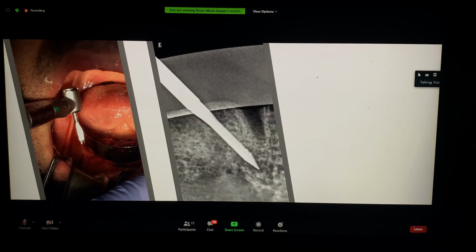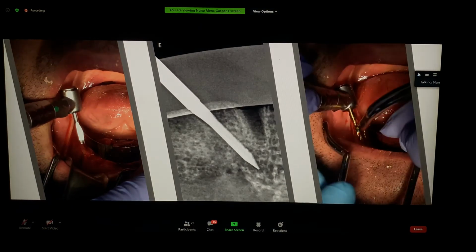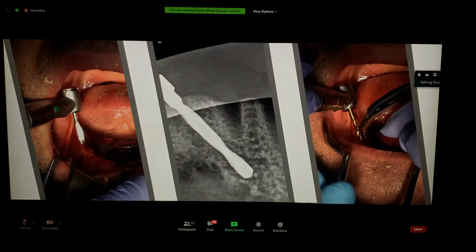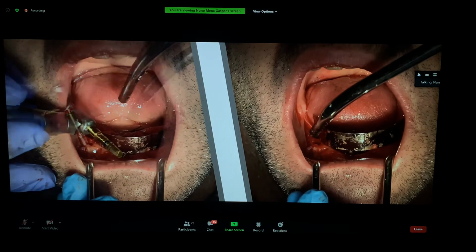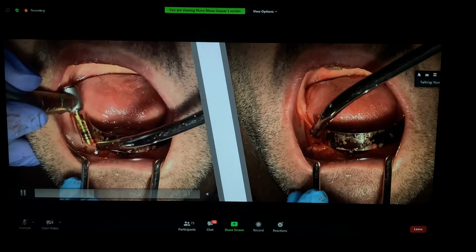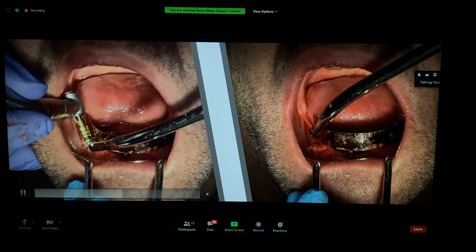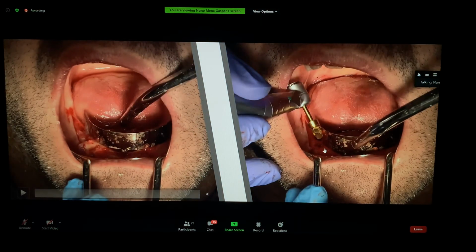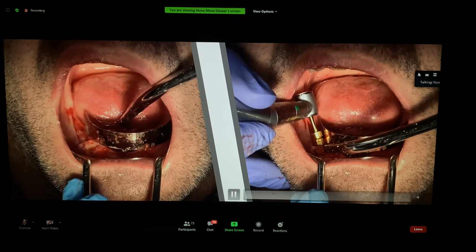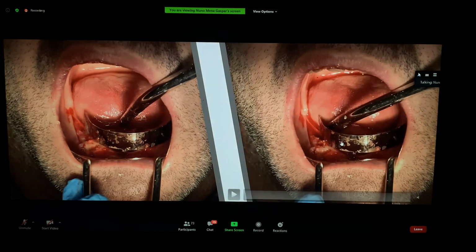Okay, so X-ray control again with the 2.0, and in this kind of bone, very hard bone, sometimes with Enerich you will need to use a drill above the implant diameter. So here I'm placing a 4.5 implant, and this is the 4.8 drill, just with 7 millimeters. Ở đây thì tôi sẽ cắm con implant là 4.5 và tôi dùng mũi khoan đến 4.8.